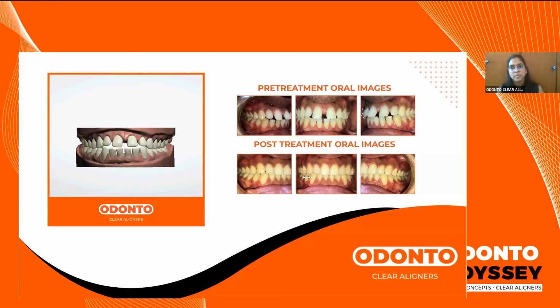and then send a fresh scan. That saves us time at our end, and it avoids fit issues in case you ask for retainers while the attachments are still present on the teeth. So if you remove the attachments at your end, it ensures that the fit of the retainer is always better. That's how it will be.